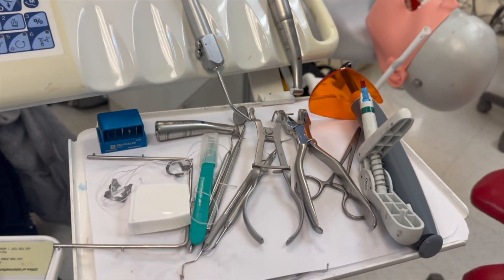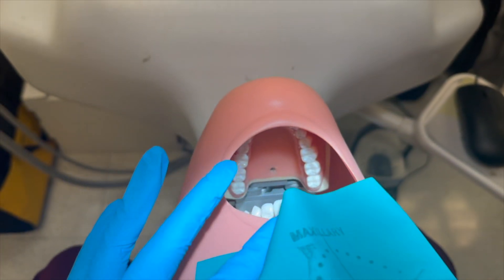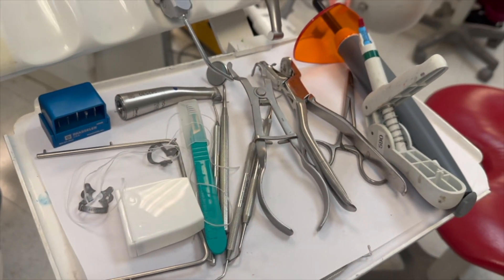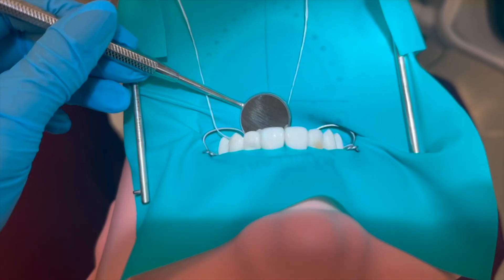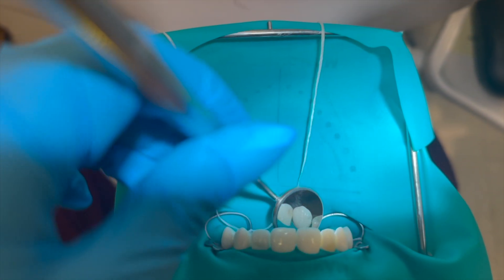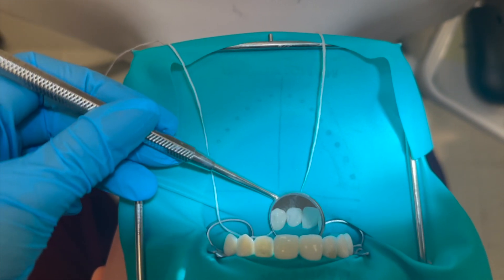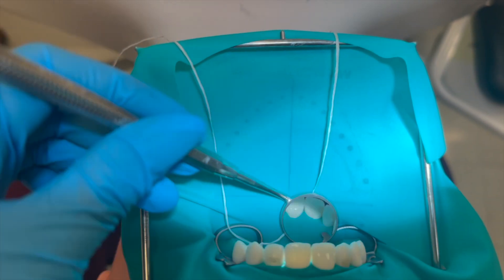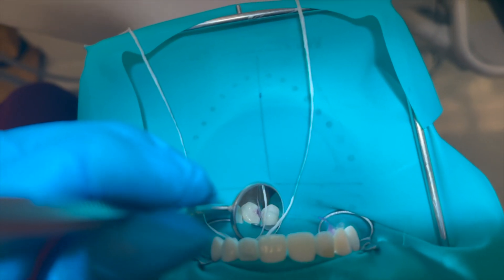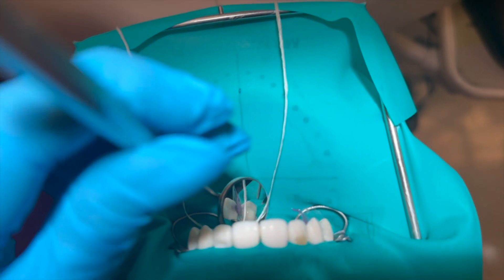Today we're doing a Class 3 restoration on the distal of maxillary anterior teeth. I'm going to put on my rubber dam and I'll show you guys the rest of the process. My rubber dam is in place and I'm going to fill this tooth as well as these two teeth today. Here's my application of the acid etch — we use this clear strip to separate the tooth from the adjacent tooth so that we don't etch the other tooth.